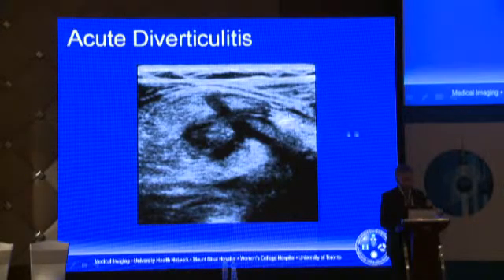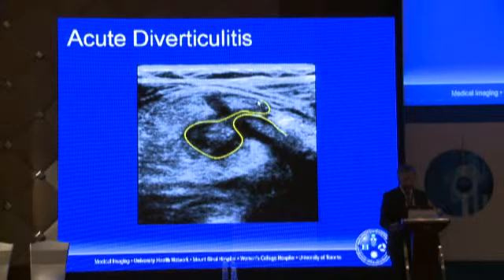Here's a very nice example. Realize that this is a more distant muscularis propria, the submucosa, the lumen of the sigmoid colon, and then on this side, the submucosa is thickened and more prominent. The muscularis propria is thickened and more prominent, and there's the inflamed diverticulum. You can actually follow it out from the mucosa, and then there's a large horseshoe of inflamed fat. And often with ultrasound, this is a very easy diagnosis because, again, the patient can pinpoint the spot.